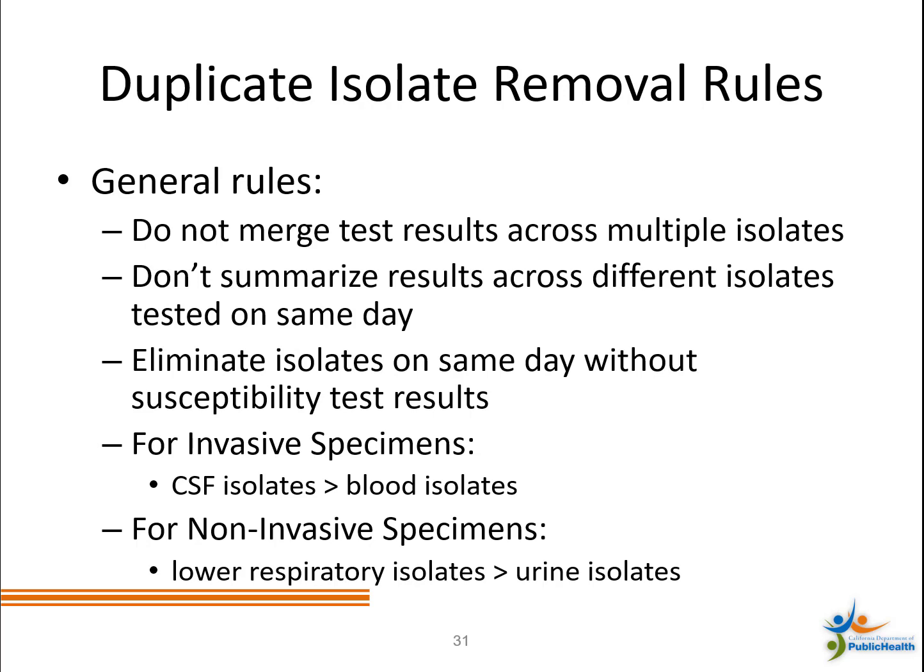Before we start eliminating any isolate, there are some ground rules that we should always follow. Do not merge or summarize test results across multiple isolates. Each event should be treated independently. And immediately eliminate any duplicate isolates without susceptibility test results.